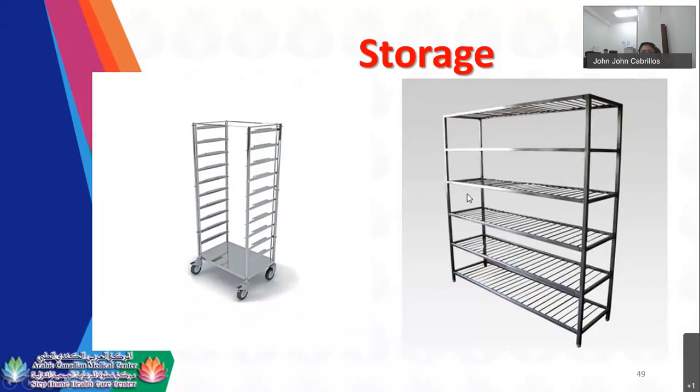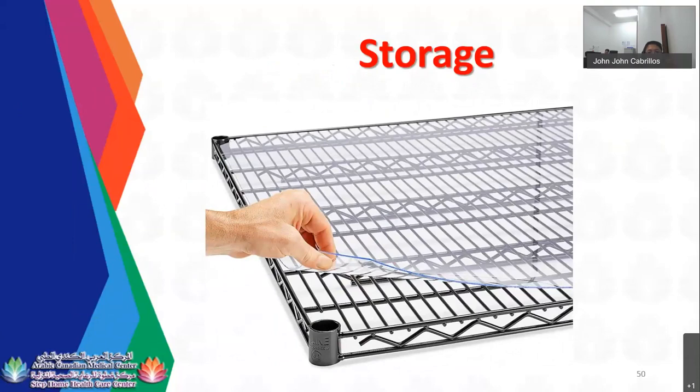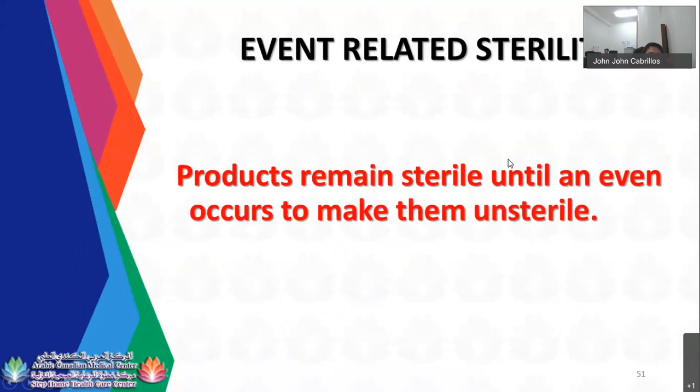So this is a sample of your shelf liner, so that we can protect the bottom part of your packages once somebody is cleaning the CSSD or someone is cleaning the floor. Your packages will not be contaminated. So products remain sterile until an event occurs to make them unsterile.